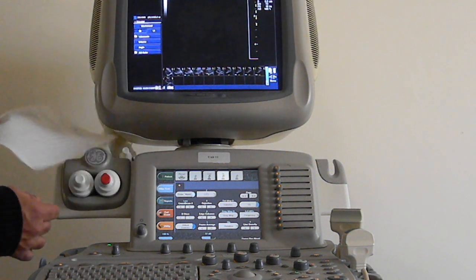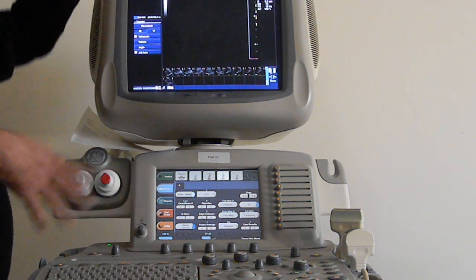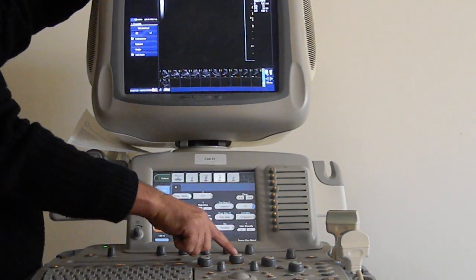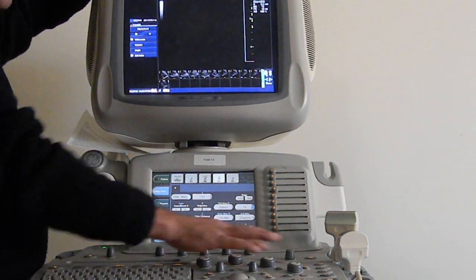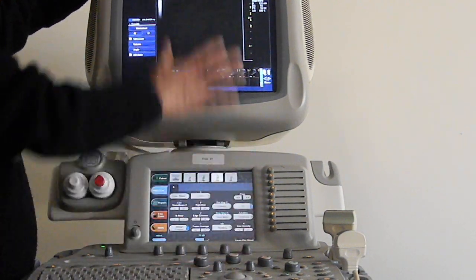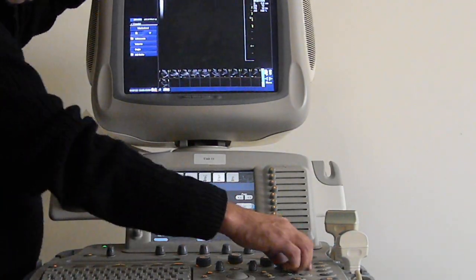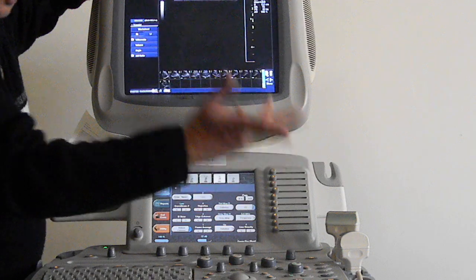So, spectral Doppler. Now, ladies, usually when you say spectral Doppler, it is going to be our pulse wave Doppler. So this key here, PW, that's your pulsed wave Doppler. These two knobs here are the Doppler function knobs, color Doppler and pulse wave Doppler. So this is your standard B-mode image, that we can make brighter if you want to. Oh, that's okay, that's bright.